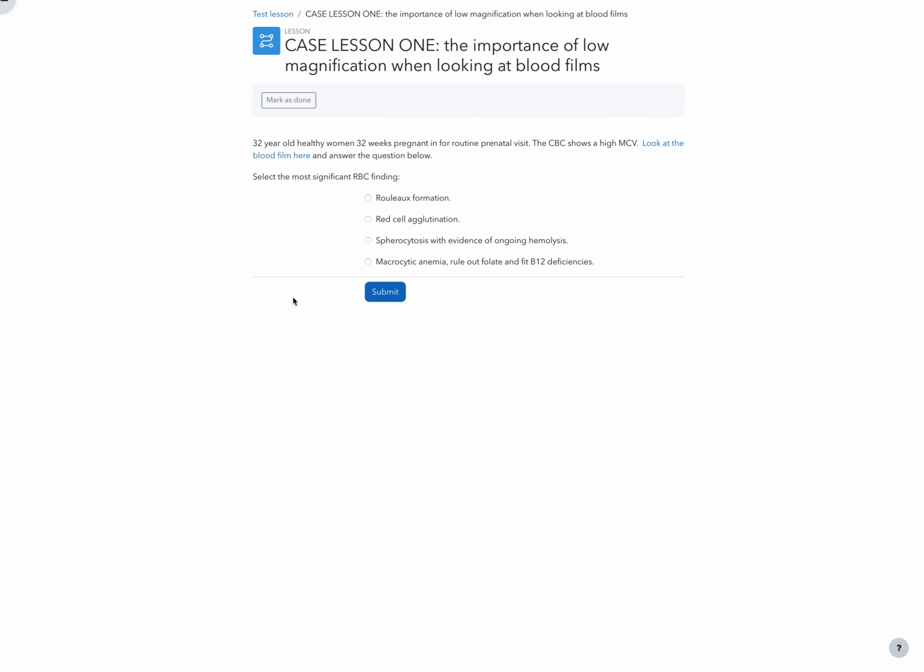So this is an example of immersive interactive learning using an online education platform like Moodle that is married to robust virtual microscopy. For any more information, please reach out.